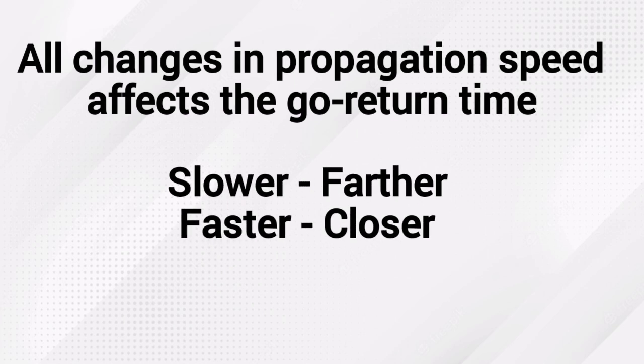that lipoma ahead of it. So you need to remember the effect of a change in propagation speed on the go-return time. So slower to farther and faster to closer. If you have a slower speed of sound, you have a farther image registration, and if you have a faster speed of sound, you have a closer image registration.